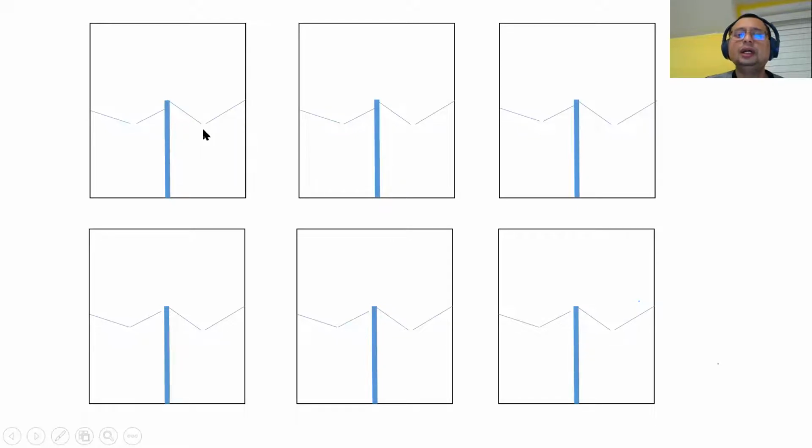Okay, so let's say you look at the echocardiogram and suddenly you see that on the left side the valve is attached more apically, then you know that the right ventricle has gone to the left side. Okay, so this is the correct arrangement: left ventricle and right ventricle. Look at the different attachment between the mitral valve and tricuspid valve. Therefore, if you have a hole here, you can have a shunt between the left ventricle and the right atrium, otherwise known as a Gerbode defect.